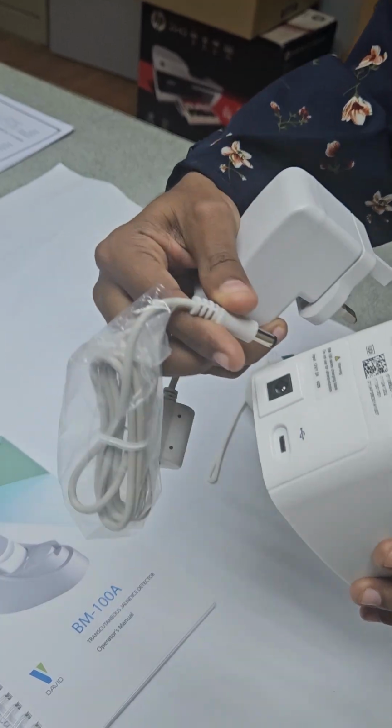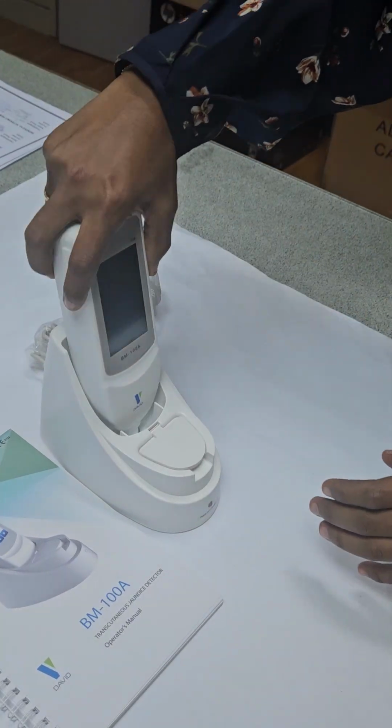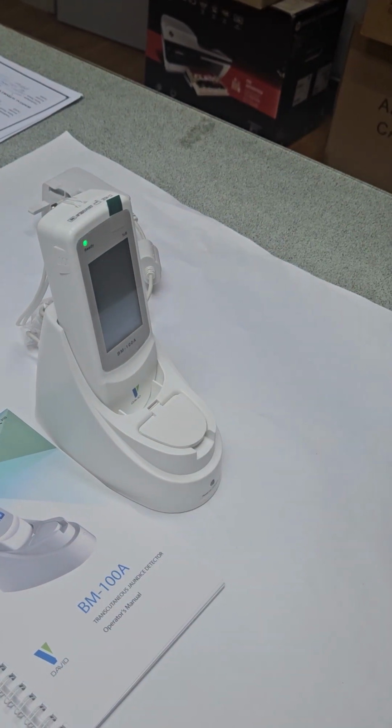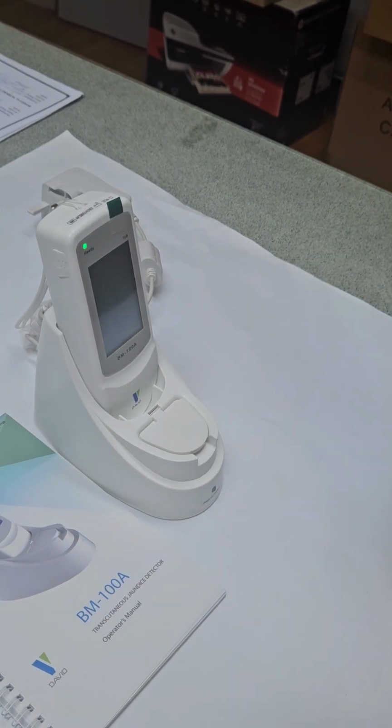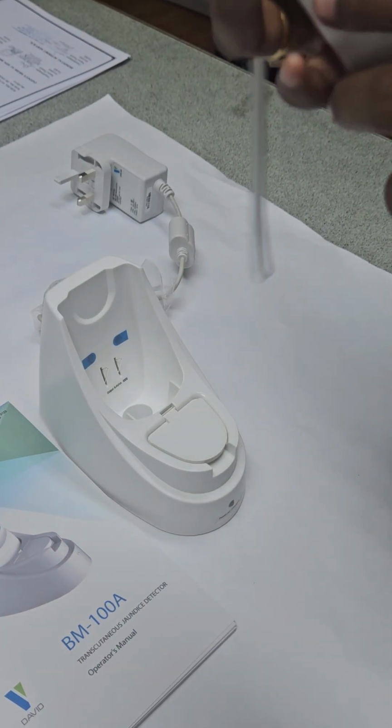The connection is at the back. So you can just leave it for charge. How long for each charge? The first time is 8 hours, because this is a new unit. After that, it depends, because there's an indicator.